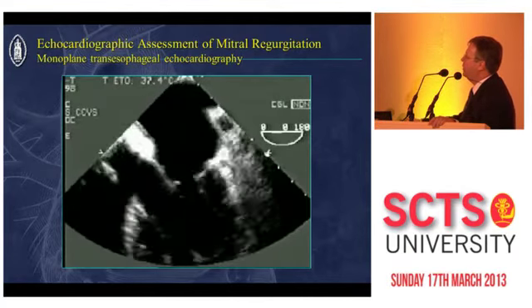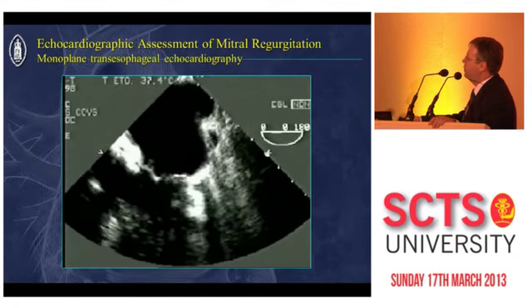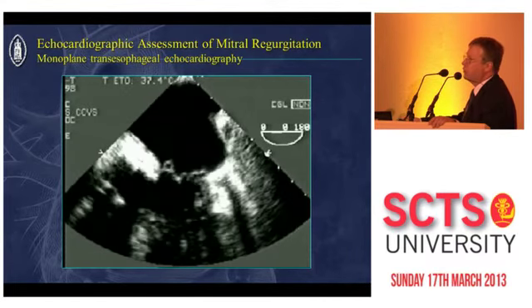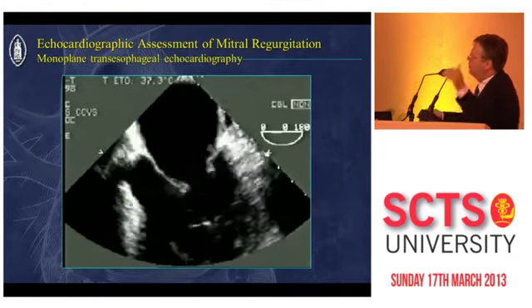Just an example live. You see here we're very high up. We see the aortic valve. So this is A1 and this is P1. And this view should always be taken, although the valves look small. Here was the pathology. That was an abscess on A1. It could of course have been missed if we didn't cut so high in the esophagus.